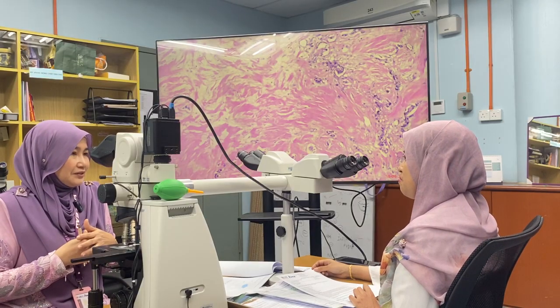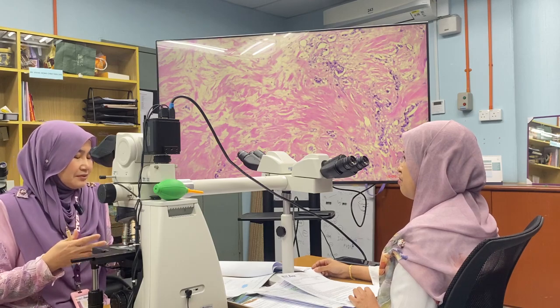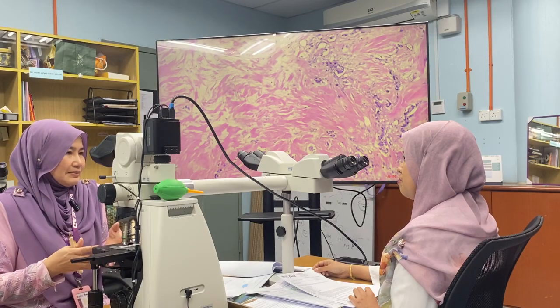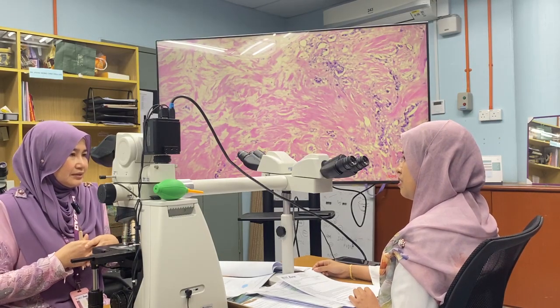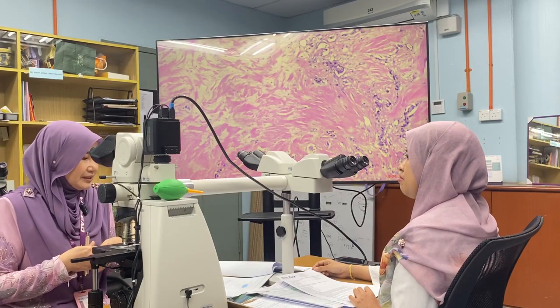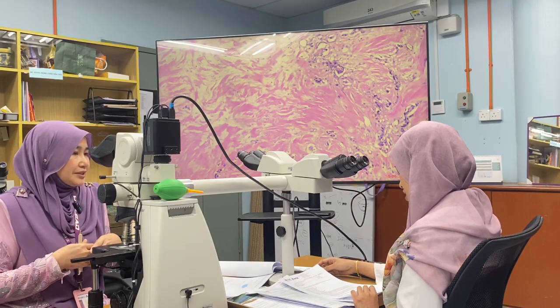And for the lymph nodes, apart from counting how many lymph nodes are involved, what else do you need to examine? Whether there's any capsular invasion, or we call it extranodal extension. Do you report that in our case? Is there any extranodal extension?